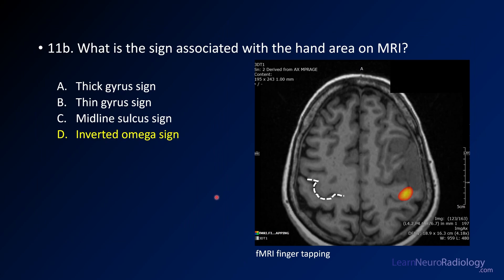The answer to the anatomy question about the sign associated with the hand area is the inverted omega sign. It looks like the Greek letter omega, just upside down — this area is known as the hand knob. This image from a task-based fMRI during finger tapping shows cortical activation in that region. Since this patient was having hand difficulties and difficulty writing, it's easy to understand why, given the location of this tumor.